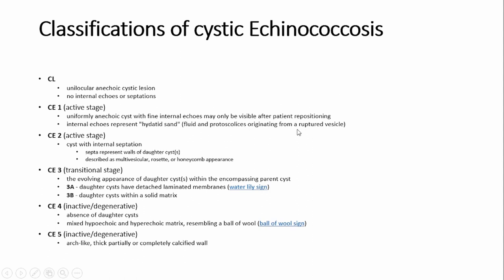You can also find internal echoes represented by a high-density sediment, which is fluid and protoscolices originating from a ruptured vesicle. CE2 is also part of the active stage. In this category, you will see cysts with internal septations. Septa represent walls of daughter cysts. You can also describe multivesicular rosette or honeycomb appearances.